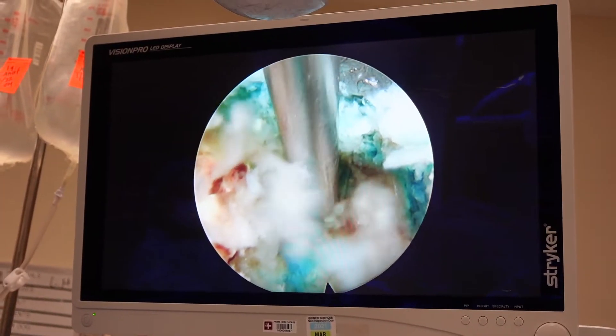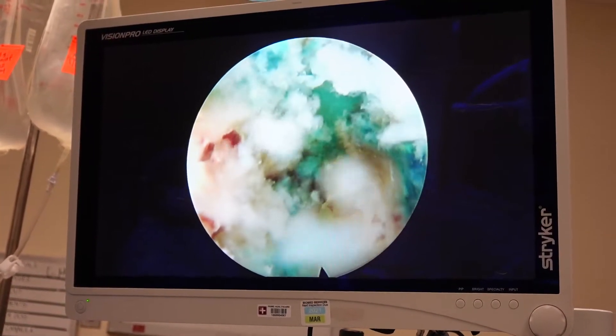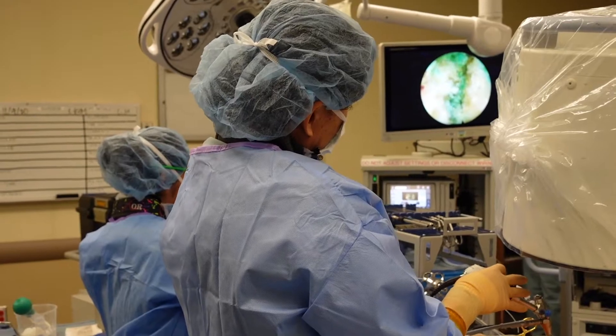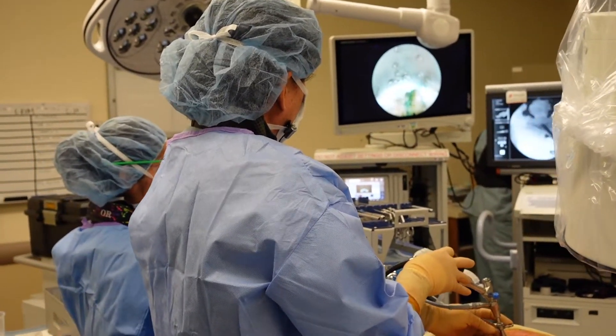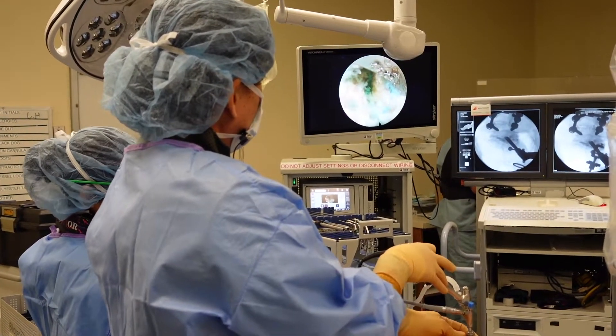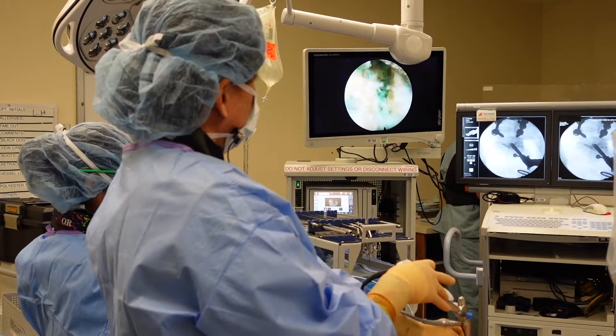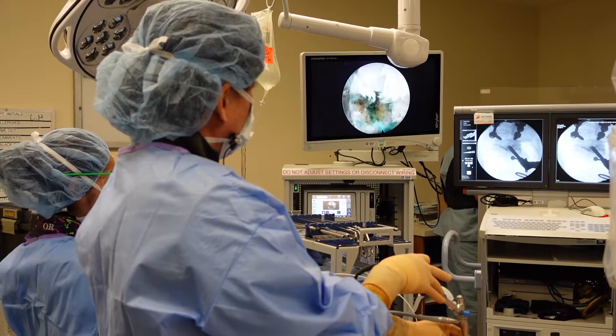That bright blue stuff is gone, but there's still some there. I can tell where I am on x-ray. I'm definitely over enough because I know exactly where the annular tear is on the MRI — most of it was over here. You can tell I got it all. There are a few little blue-stained pieces that I can get on the way out.